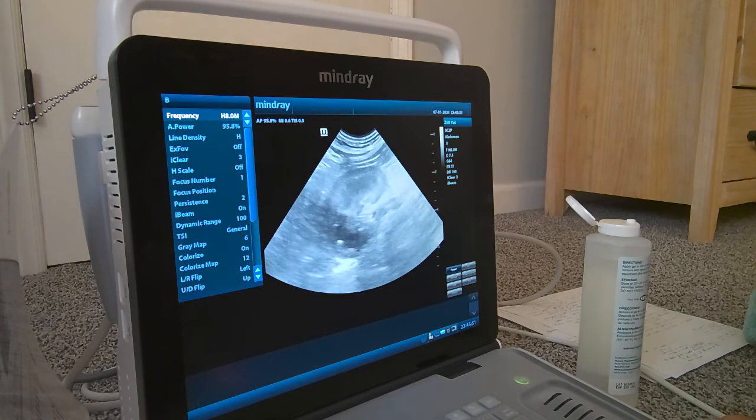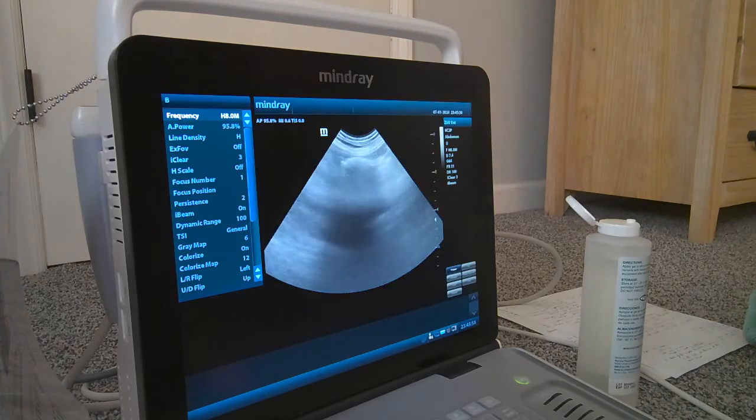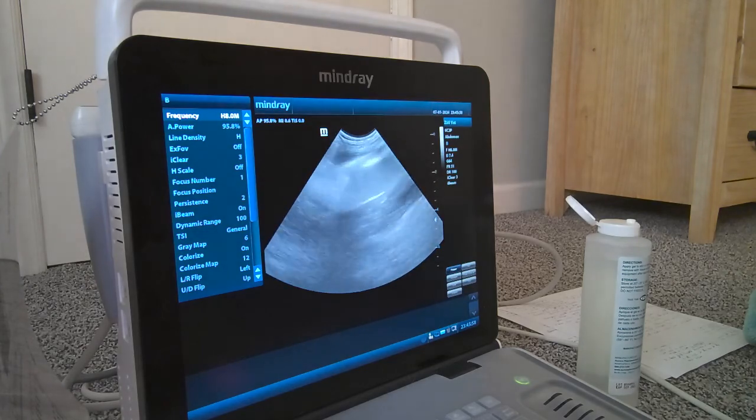All right. We actually saw a little bit of the adrenal gland coming in already. Nice. All right, so we will look at our next organ in a second. Thank you, everybody.